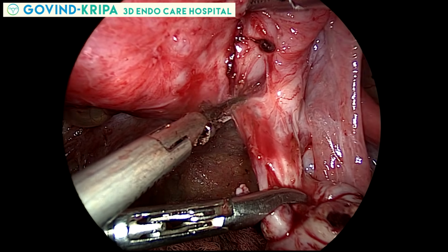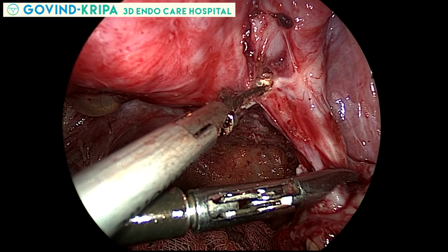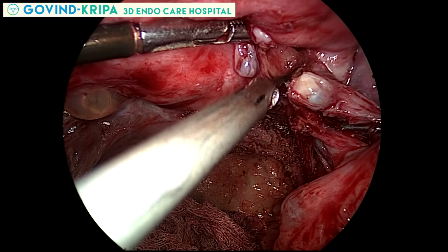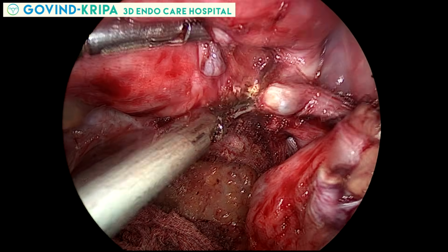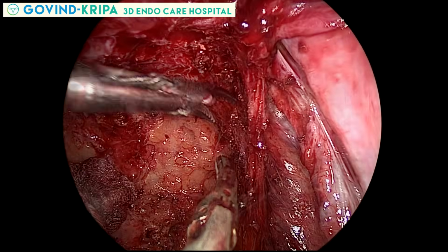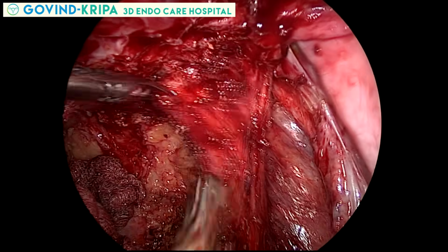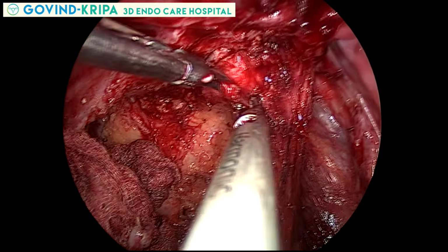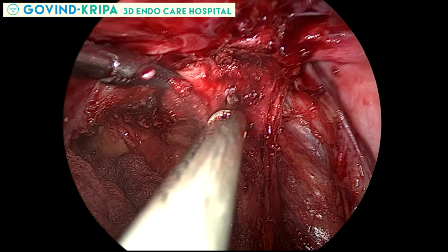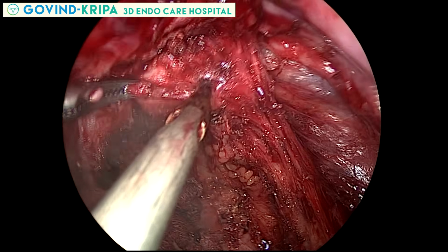Small endometriotic deposits around the ovarian ligament are noted, and ovarian ligament is skeletonized, and afterwards this nodularity will also be excised. Small implants on the vagina are also cut excised.